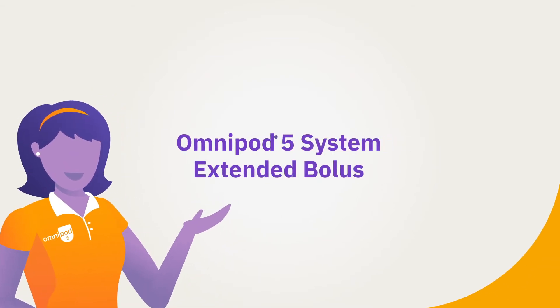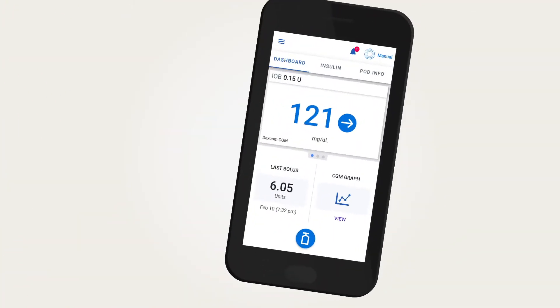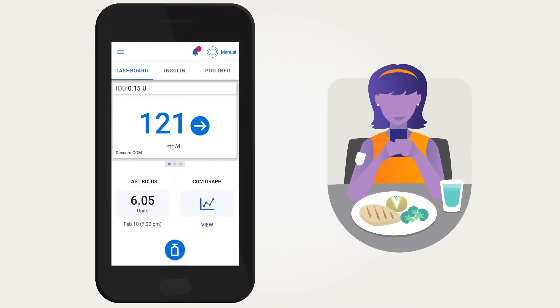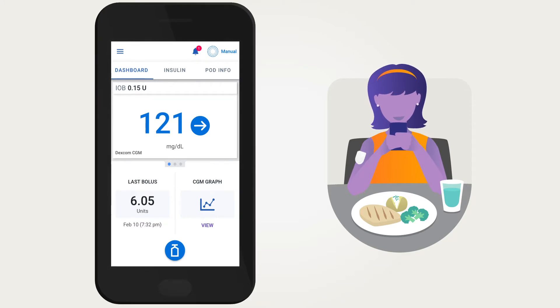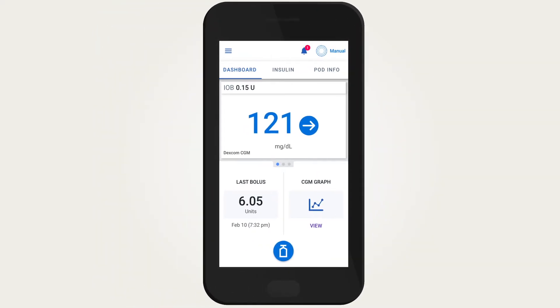Omnipod 5 System Extended Bolus. When using manual mode with the Omnipod 5 System, you may find that certain meals with high-fat and high-protein foods would benefit from a bolus dose delivered over a period of time instead of all at once. Programming an extended bolus could help in these instances.